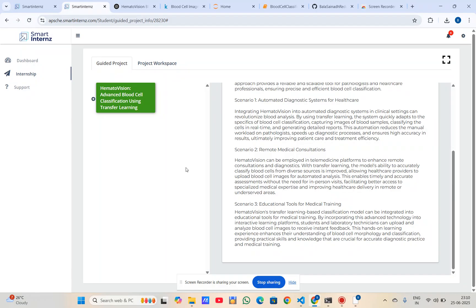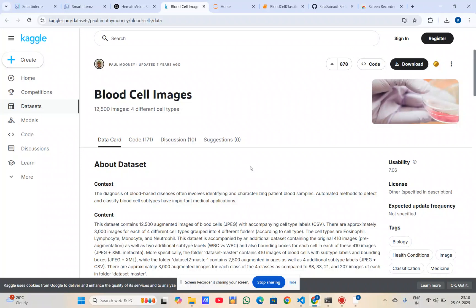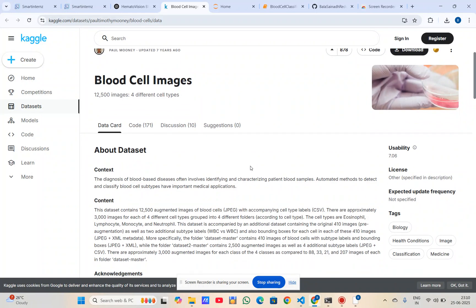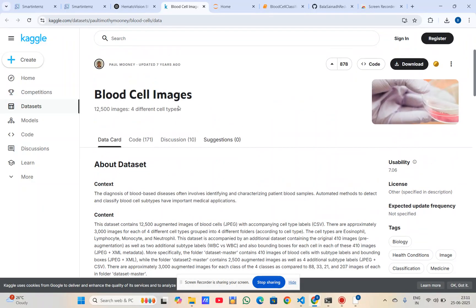Now let's see what dataset we used and how we trained the model. We took the dataset from Kaggle. The dataset contains thousands of labeled images under four classes. The structure includes folders like train and test, and from here we can download the training and test data.